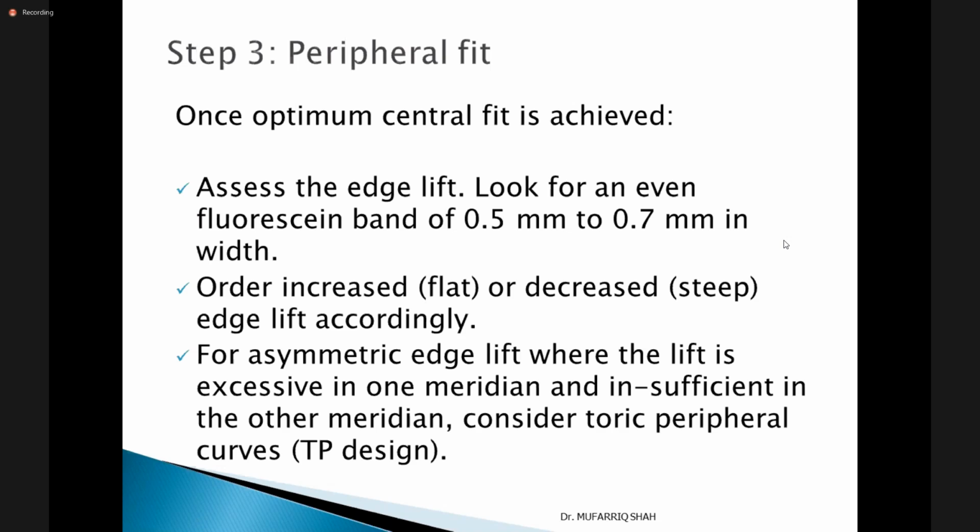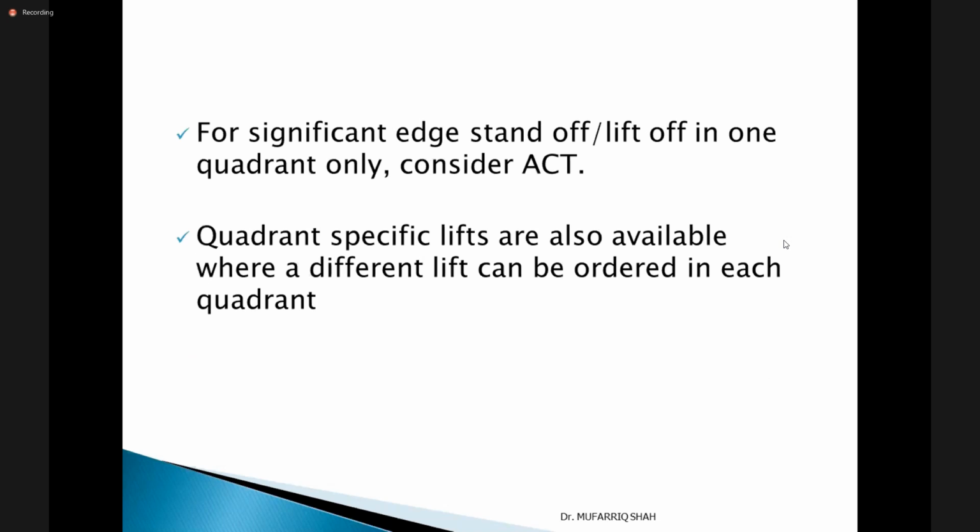In toric peripheral design, you can change the edge lift at any desired quadrant. These may be superior and inferior, or both superior and inferior, or temporal.